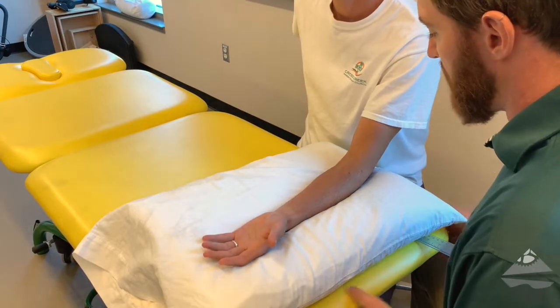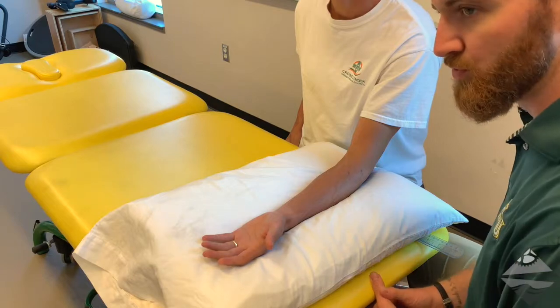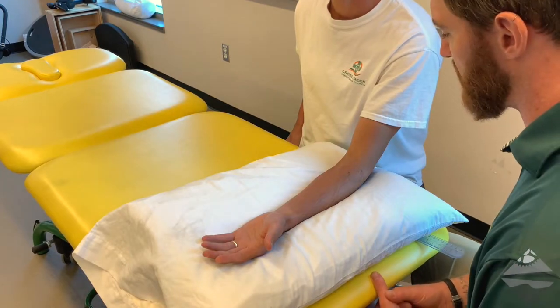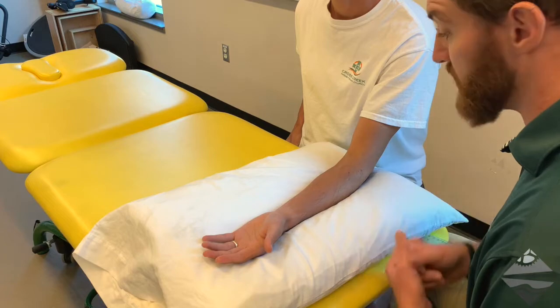Today we're going to be talking about palpation, observation, and range of motion assessment in and around the elbow. Before we get into the range of motion assessment, let's do a little bit of a palpatory exam, appreciating where some of the anatomy is and appreciating the various structures.